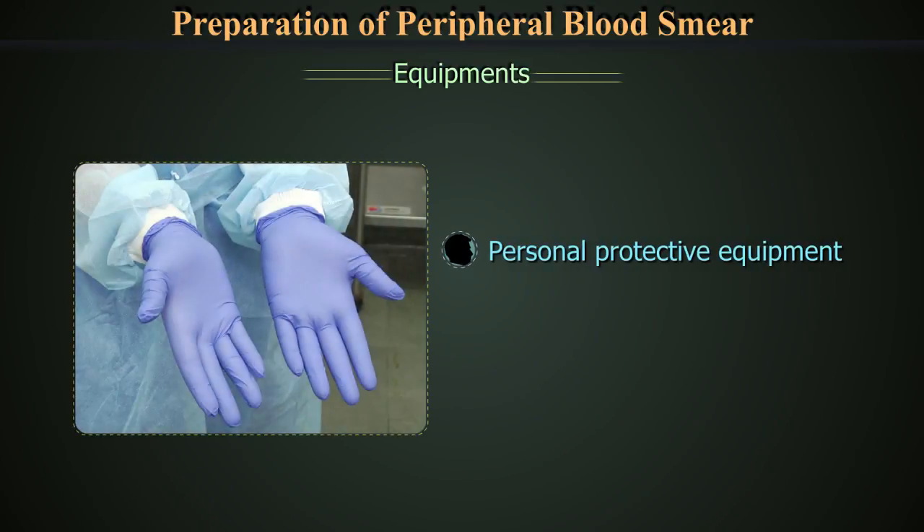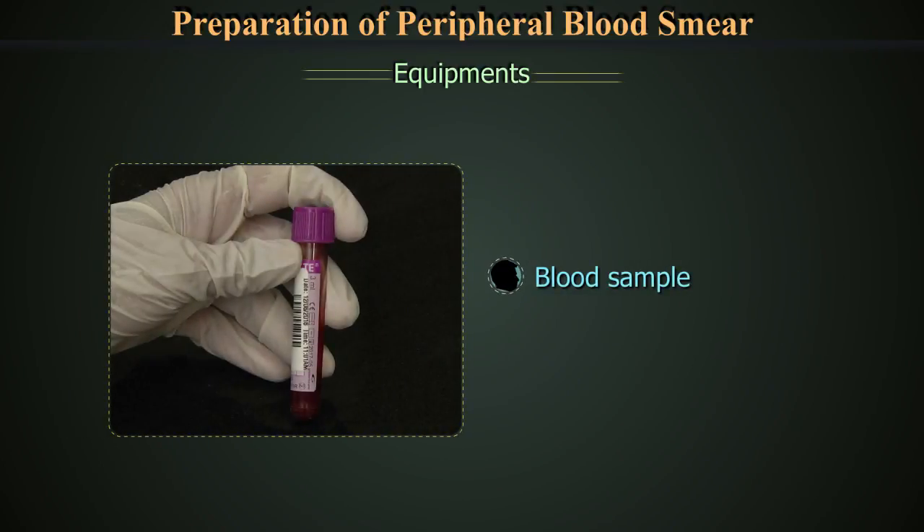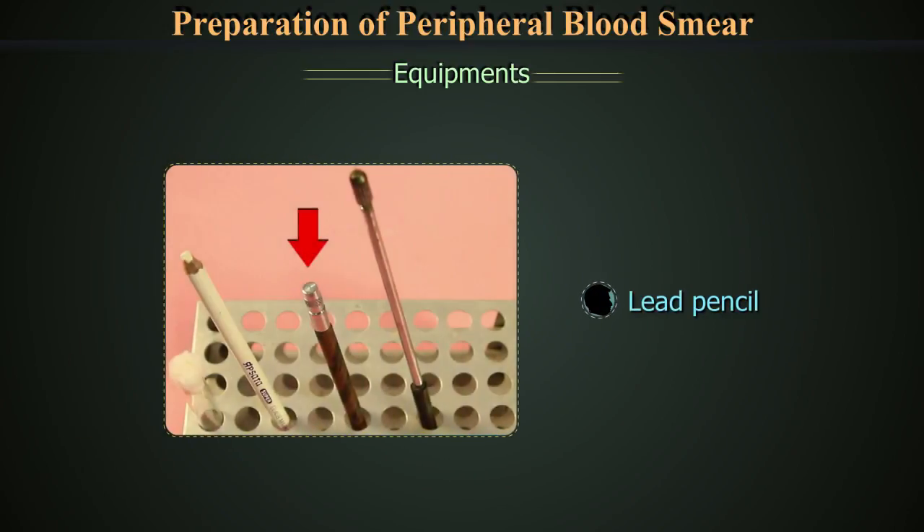An applicator such as a capillary tube, personal protective equipment with gloves, and a container with 1% hypochlorite for discarding capillary tubes. Use blood collected in EDTA, which is preferred, with identification and lead pencil.